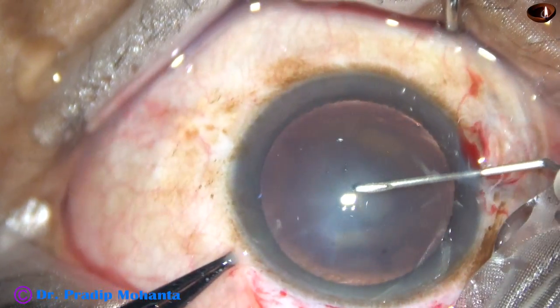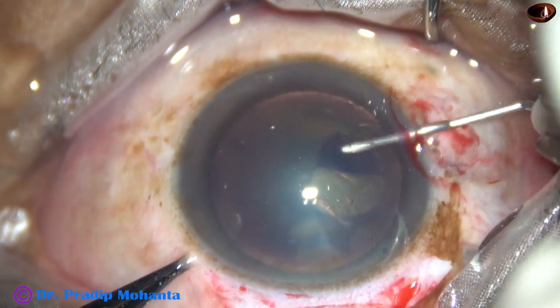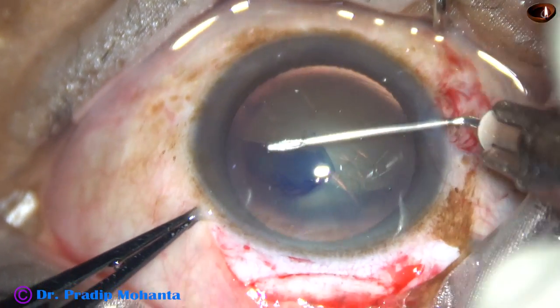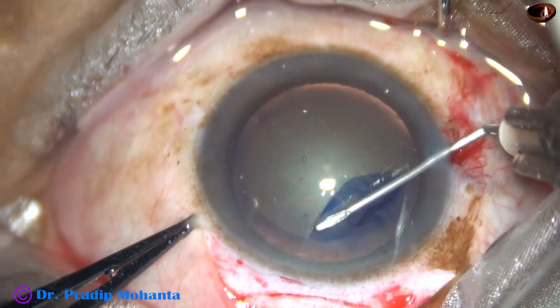This is capsulorhexis with the help of a cystitome. A 26-gauge disposable needle has been bent to make this cystitome. And the rhexis is done.